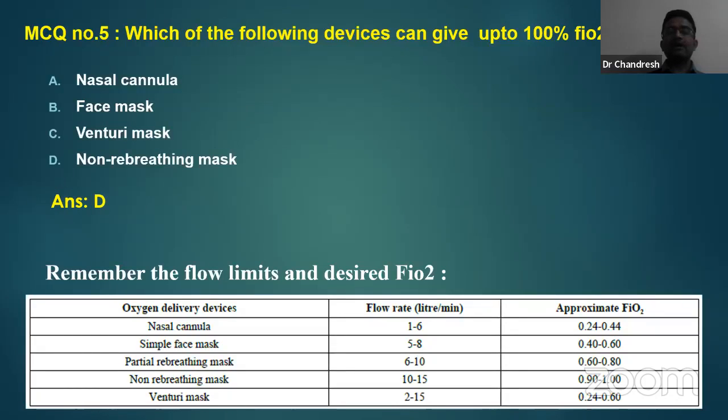As I told you previously, a nasal cannula should never cross more than 6 liters. Even 6 is a little on the higher side. If I think my patient requires almost 6 liters, I will rather use a simple face mask than a nasal cannula. If you are using a partial rebreathing mask, consider that it can never achieve 100% FiO2. But yes, a non-rebreathing mask can achieve 100% FiO2. The only disadvantage is that if the oxygen supply suddenly gets disconnected, because of the unidirectional valve, a patient can have CO2 retention. So always be more careful while using a non-rebreathing mask. Always check for disconnection and take care of the patient.